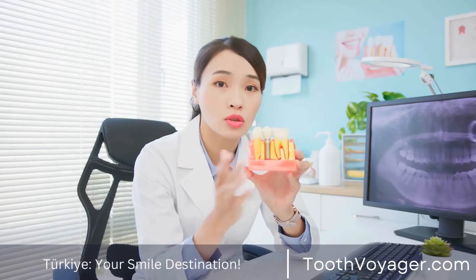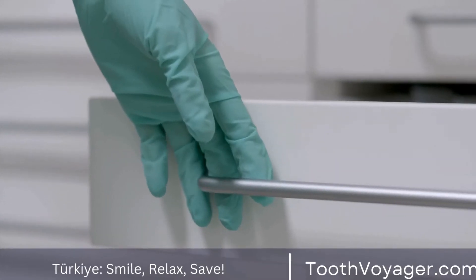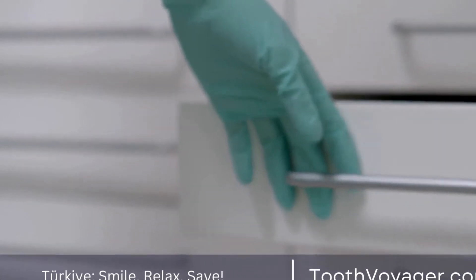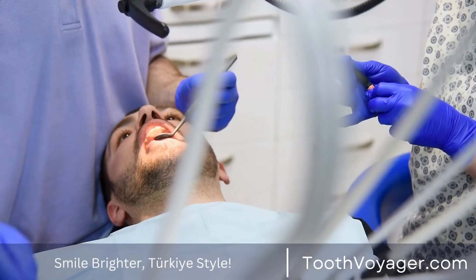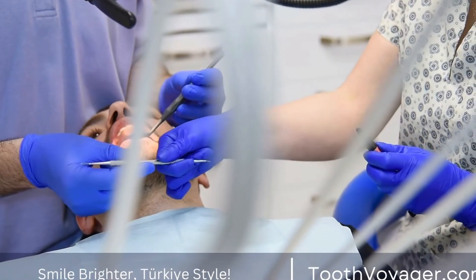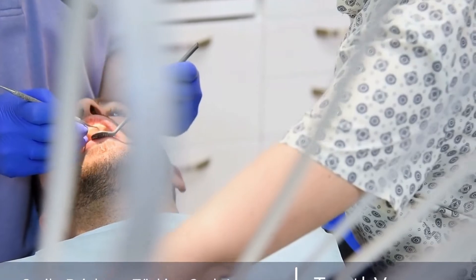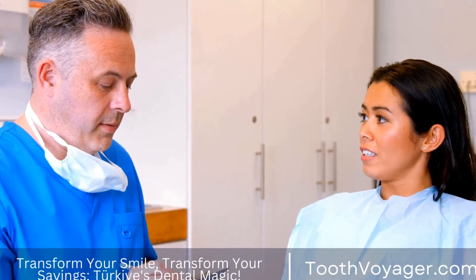The Procedure. Root canal treatment is typically performed by a dentist or endodontist, a specialist in treating the inside of teeth. The procedure is done in several steps and usually requires two or more visits to the dentist's office. Here is a breakdown of the root canal procedure.